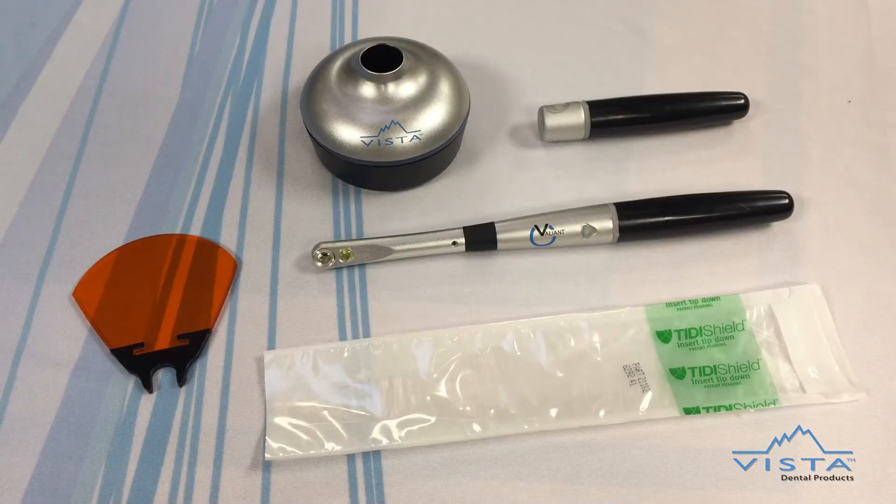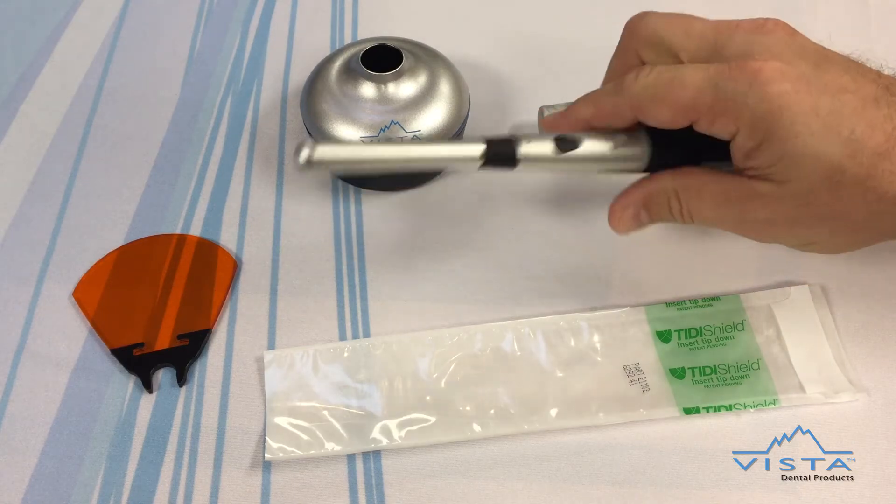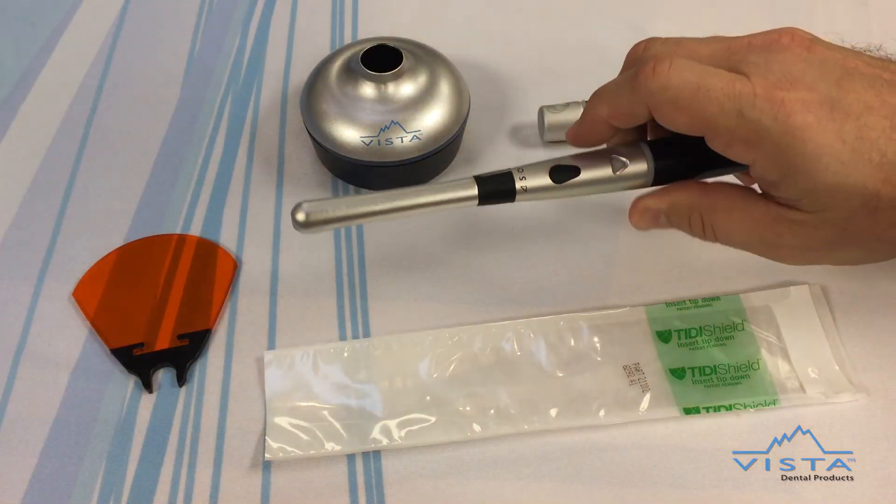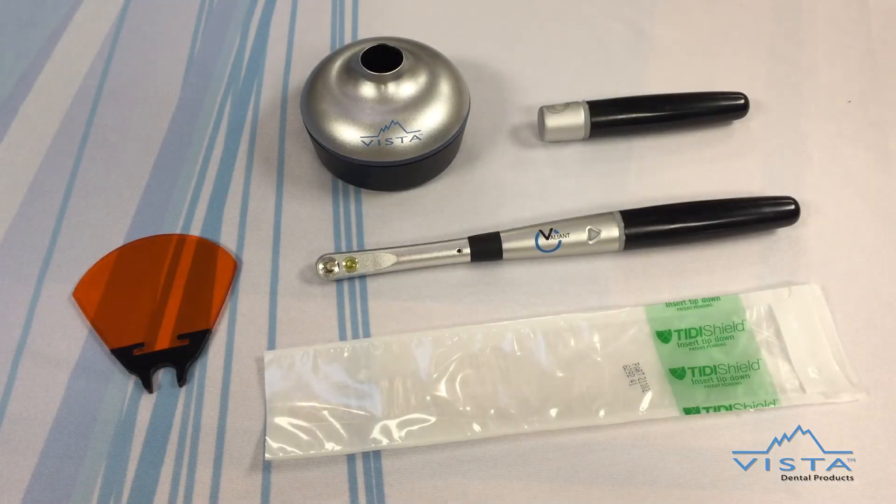The Valiant also has a transilluminator, or white light, for detecting fractures, cracks, and residual caries. The one-button soft touch on/off switch provides easy operation for both the curing mode and for the transillumination features.